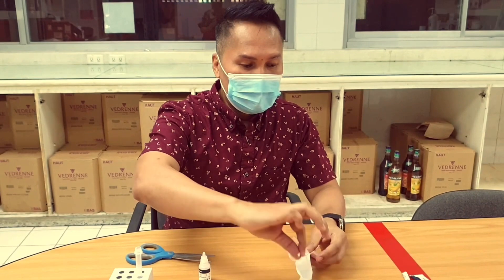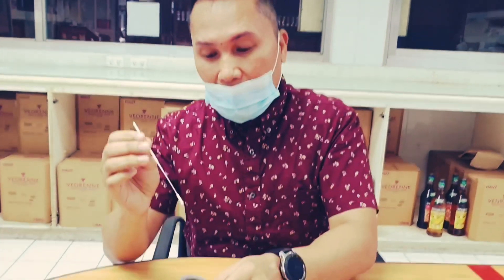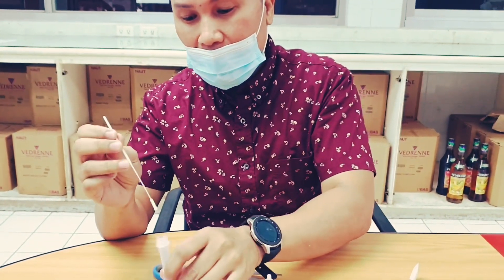Now I am ready to swab myself. Insert the entire end of the swab into your nostril, not more than three-quarters of an inch into your nose. Then slowly rotate the swab, gently pressing against the inside of your nostril, at least 4 times for a total of 15 seconds.